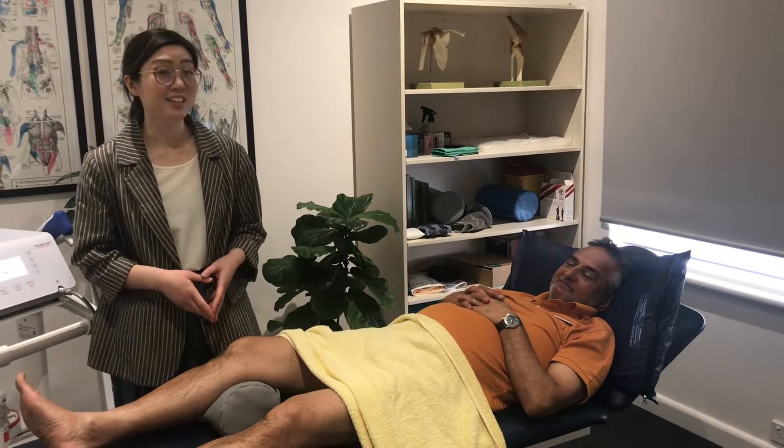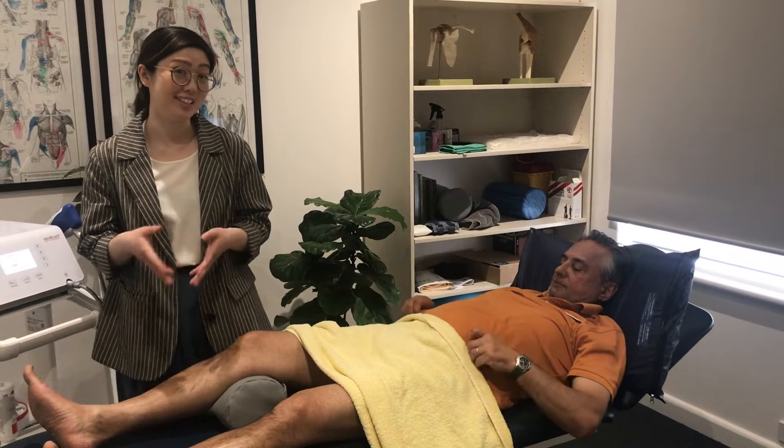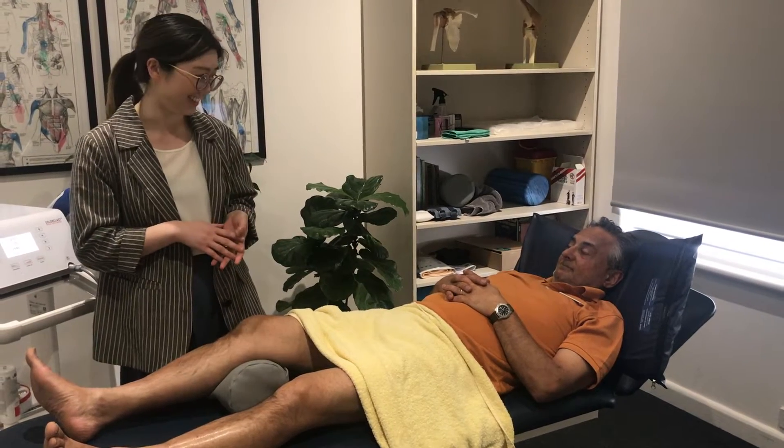We've been asked a lot at the clinic about shockwave therapy and what that actually entails. So today I'm going to demonstrate shockwave therapy with Russell on his knee that has arthritis in it.